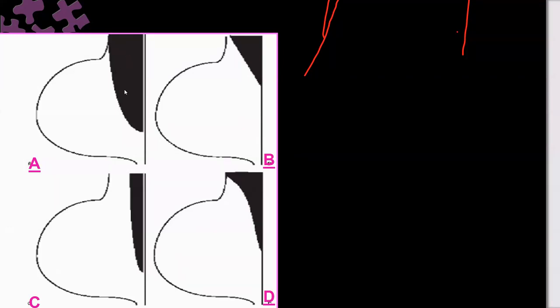If we talk about each one here, we can say the length is optimum below the posterior nipple line. The shape is convex. The width is wide in the axilla, narrow down. The angle is more than 10. When we look at this, it is very short, very high, not reaching. Though it is straight and wide, and the angle might be fine, it doesn't reach here, so it is suboptimal. This, it is concave, most important. And this, it is relatively narrow. When it is narrow, we are also afraid of missing some of the posterior breast tissue.